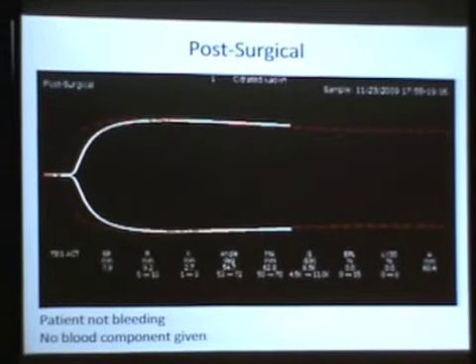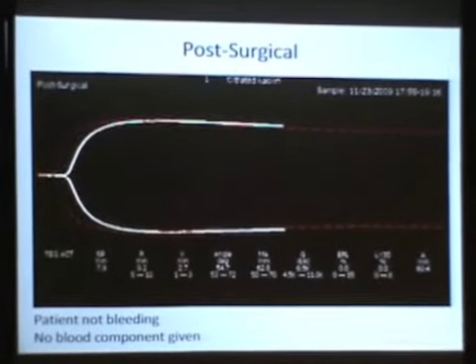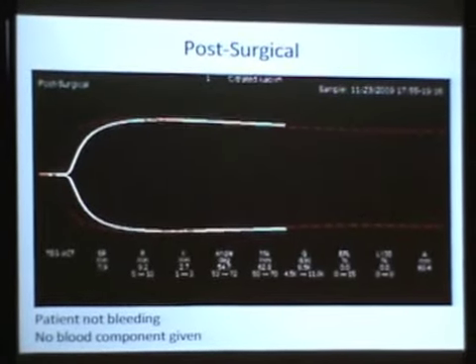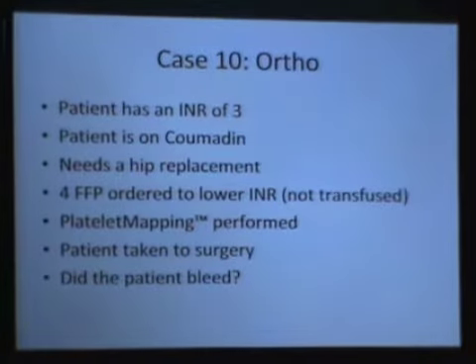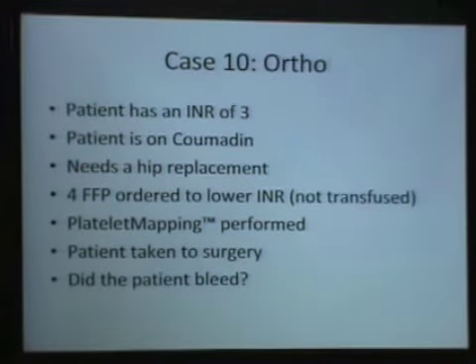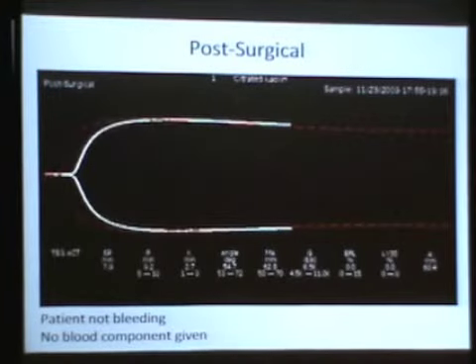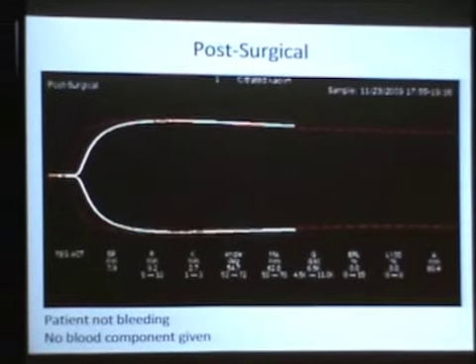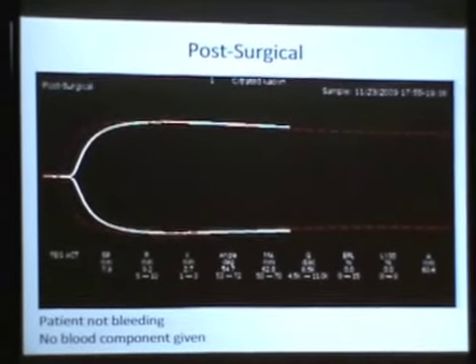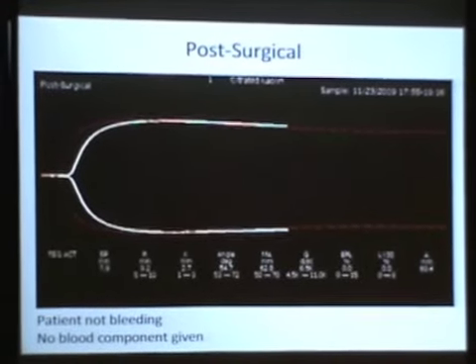And we had a trauma patient here. He was 18. They think he was texting, of course. Flipped his car. Blasted his liver. Just terrible. Dr. Zulum and the trauma team and all the nurses did such an amazing job on this guy. They ended up having to cross-clamp the aorta above and below the liver, which until this case was uniformly fatal. Didn't kill him. They'd taken him to surgery for hours and hours, taken him back to surgery again, had him in the ICU, ran a TEG because he started bleeding again.